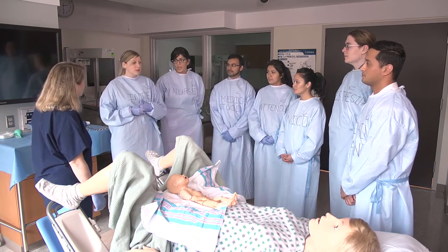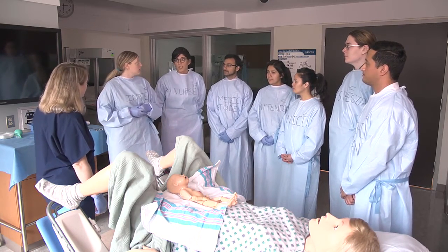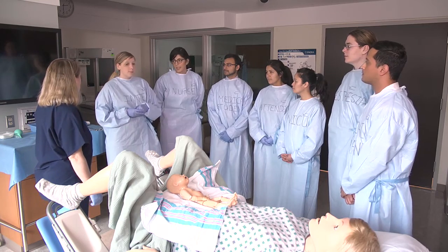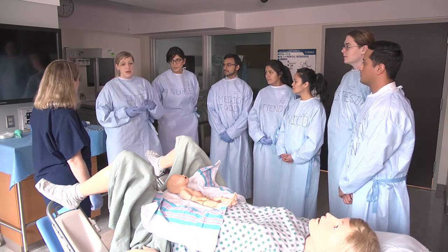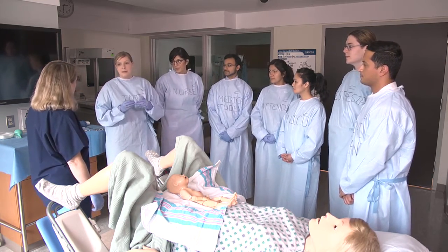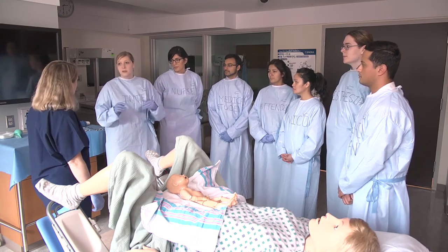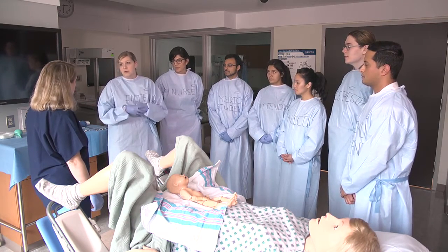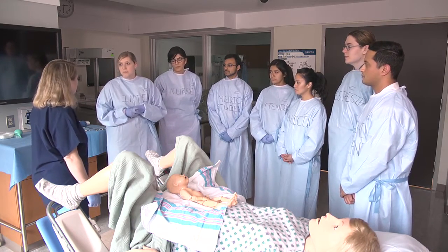I determined which side the baby's back was on so I could tell the assistants in which direction to apply the suprapubic pressure. I was calling out the time since the delivery of the head. Then I made a medial lateral episiotomy on the side of the baby's chest so that we could more effectively deliver the posterior arm.